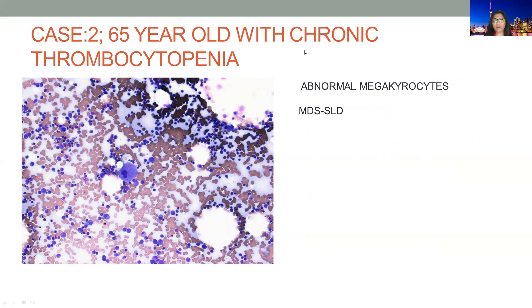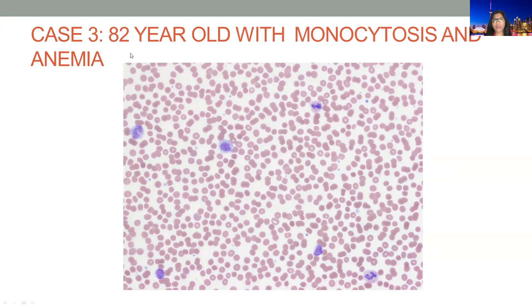Case two: a 65-year-old female with chronic thrombocytopenia. For age-matched cellularity, the marrow cellularity is not significantly increased. There are no obvious blasts and no clustering. The only abnormality is a megakaryocyte that is small with monolobated nuclei — a hypolobated micromegakaryocyte. Based on this as the only abnormality, the diagnosis is MDS with single lineage dysplasia.